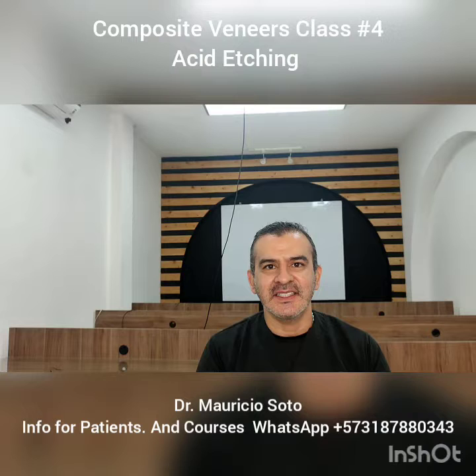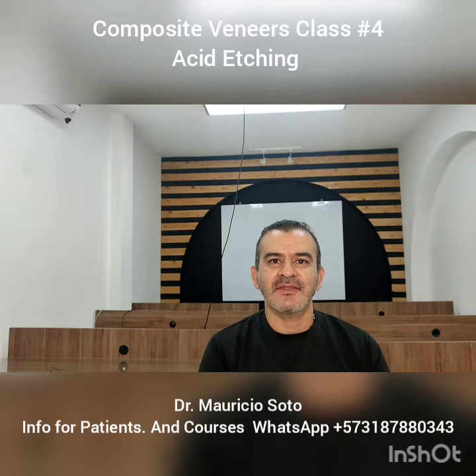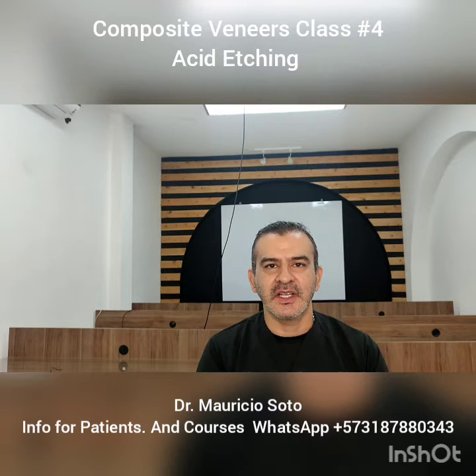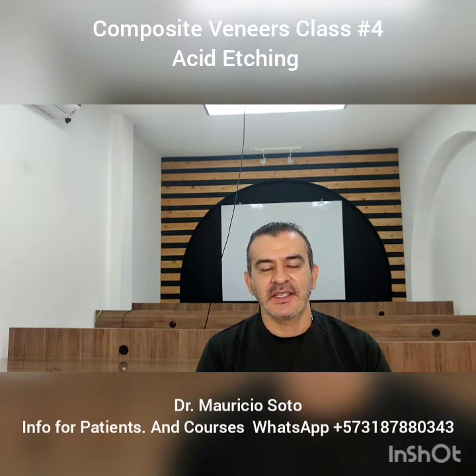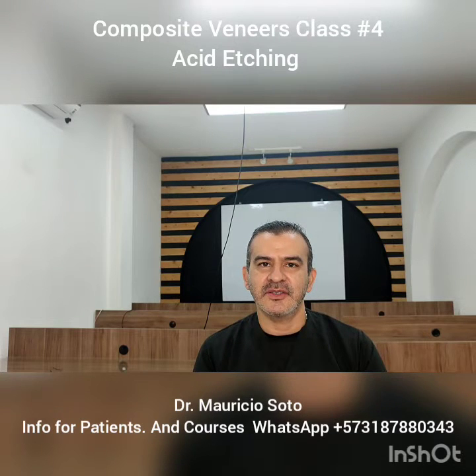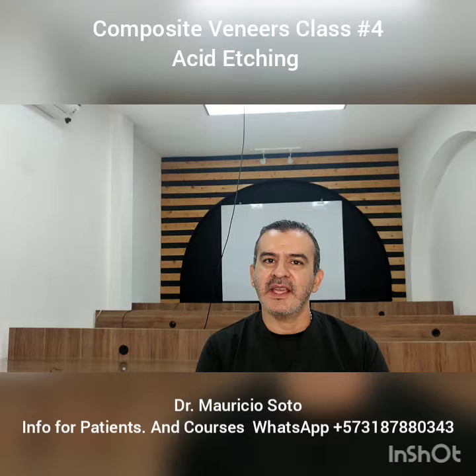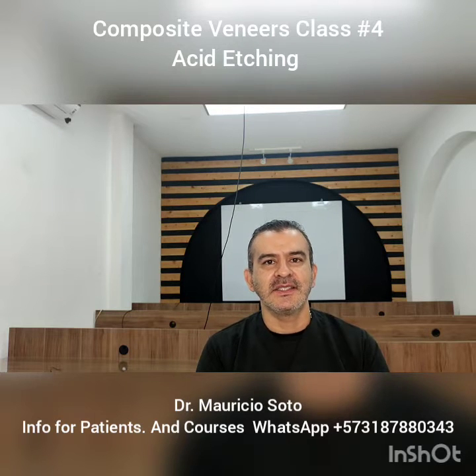The acid etching is a very important step for having a good bonding and longevity of the veneers. I'm going to show you a video of the procedure and I'm going to explain very well this important part of the procedure.